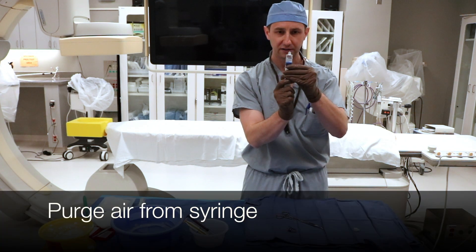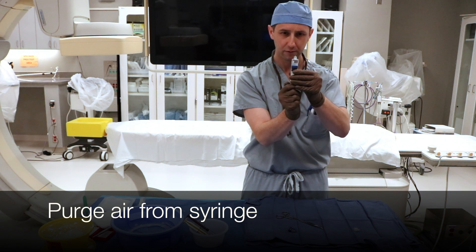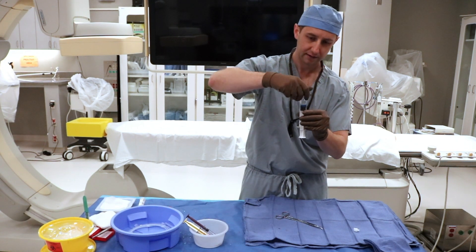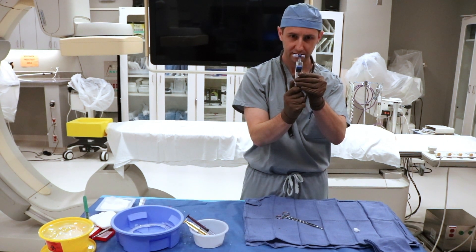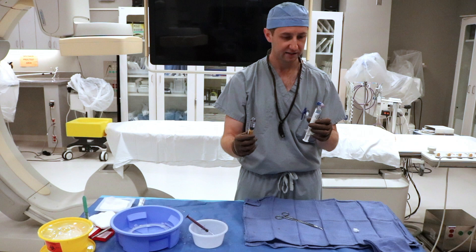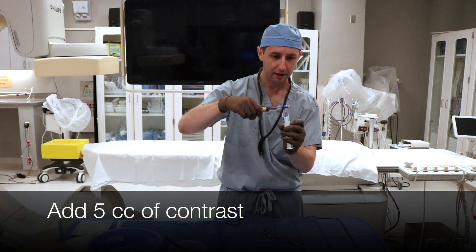All right, so the beads have settled down. Basically you're just going to purge out the air — the plunger sticks a little bit on your very first go. Go ahead and purge out the air, then connect the three-way stopcock. Purge out a little bit of saline to get rid of the air.